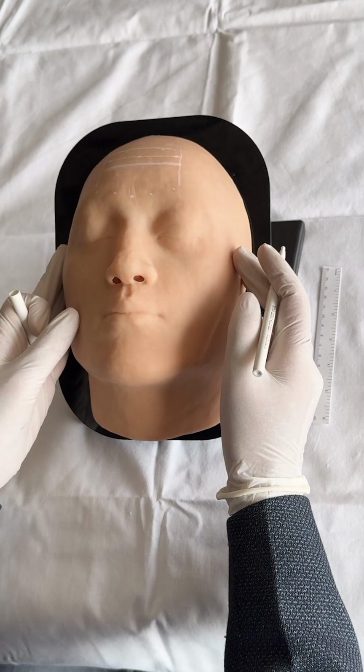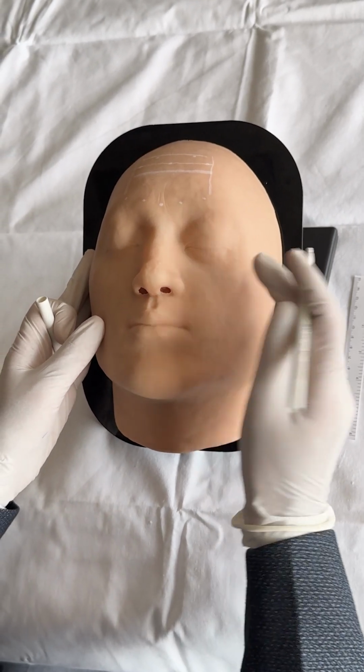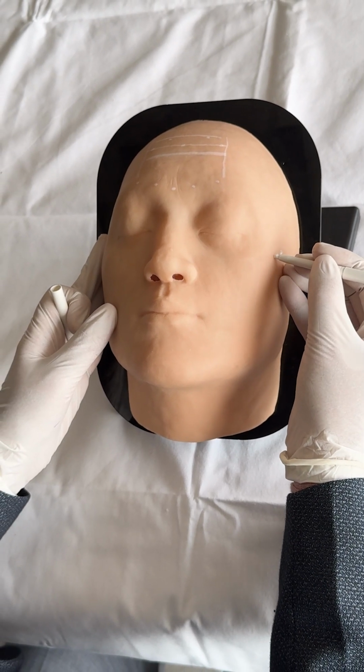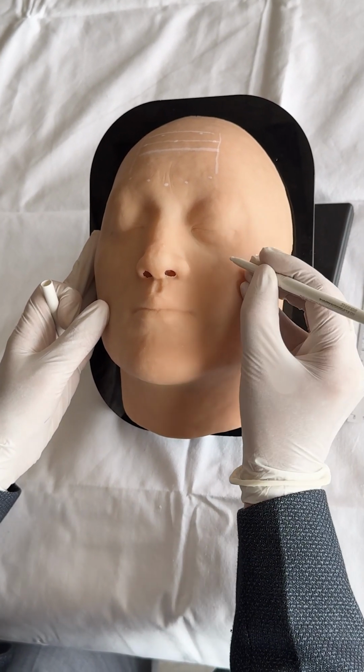If one wants to do the cheek enhancement by giving the volume to the upper part of the face, first do the marking of points and follow the standard injection techniques for fillers.